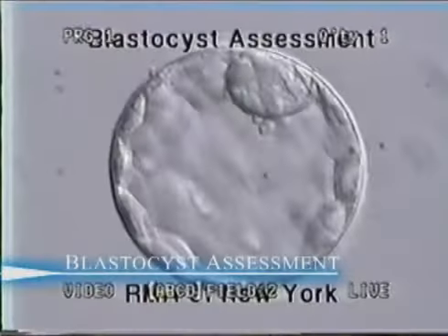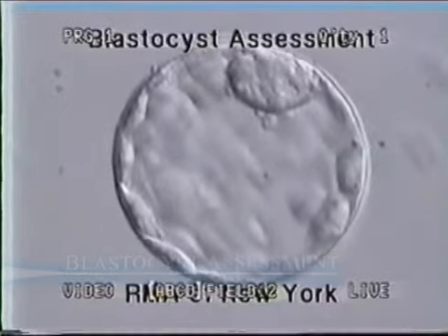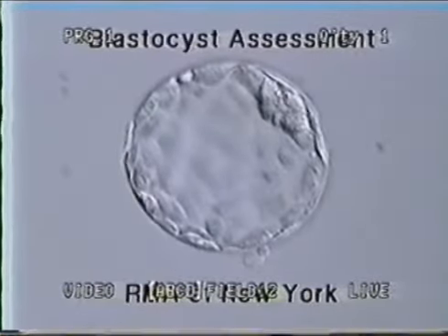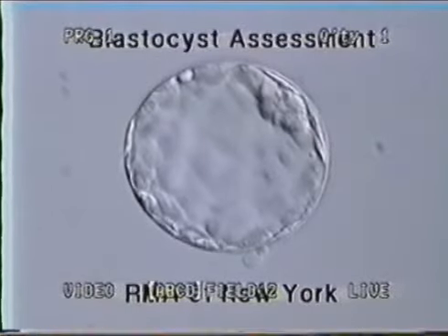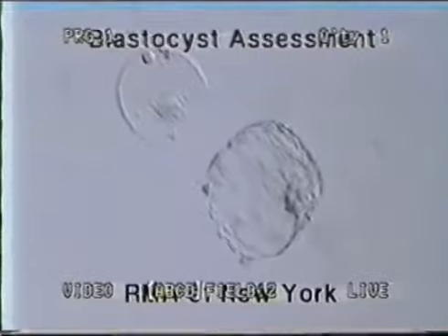If embryos are cultured past day 3, their development will be assessed on day 5 and day 6. The embryos, now called blastocysts, are assessed for potential transfer or freezing. They can range in qualities characterized by their size and the organization of cells that are beginning to differentiate around the fluid-filled blastocele cavity.